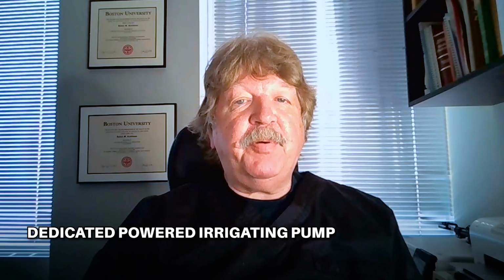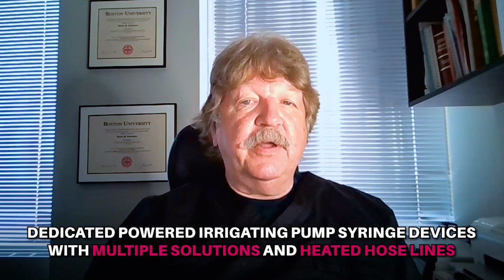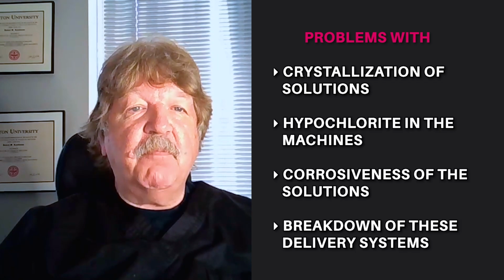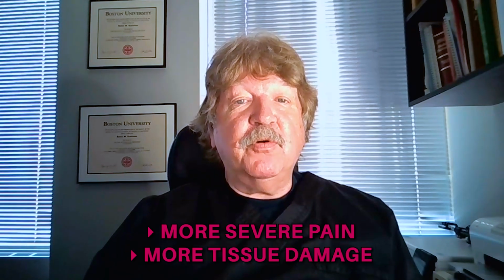I moved on to a dedicated powered irrigating pump syringe device with multiple solutions and heated hose lines. There were problems with crystallization of the solutions, hypochlorite in the machines, corrosiveness of the solutions, and breakdown of those delivery systems. They leaked a lot, and I eventually returned them. As bad as a small bit of extrusion of hypochlorite may be, and that should never happen, extruding a heated version of hypochlorite can cause even more severe pain and even more severe tissue damage. For me, it simply wasn't worth it.